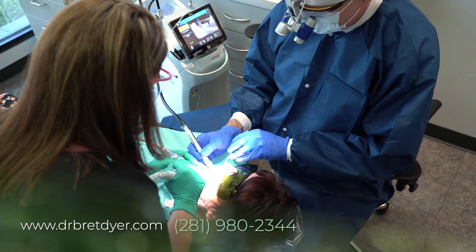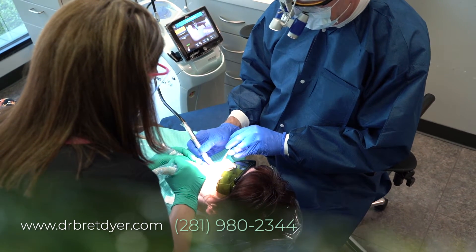Also, it's in the best position in your gums. When you smile, it just looks like teeth again. When you're having your implants restored, we'll use a laser to shape your gums so that when you smile, you see that little pink tissue between your teeth.